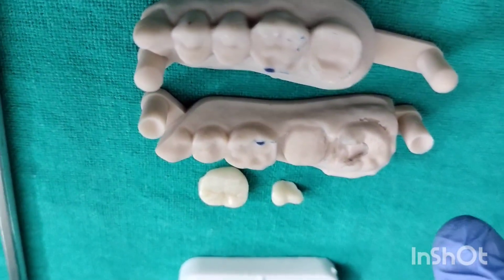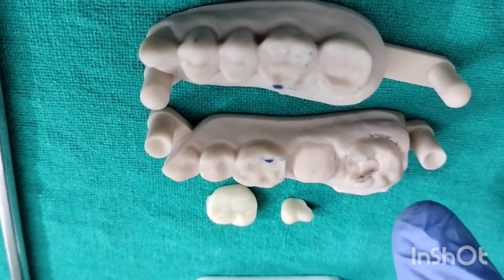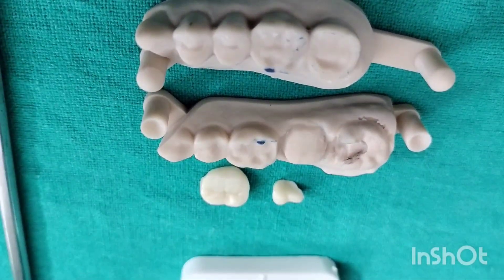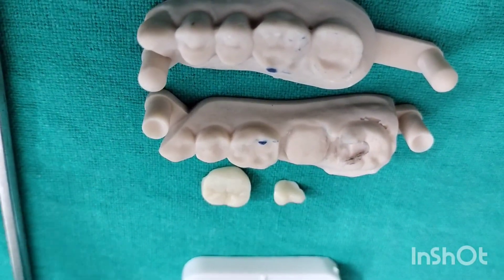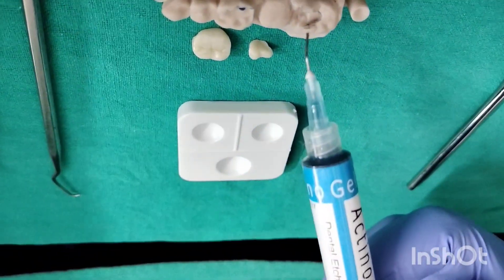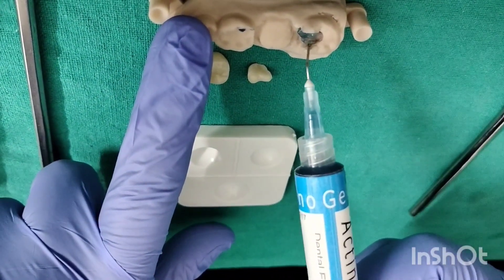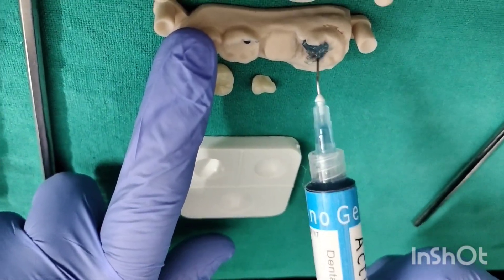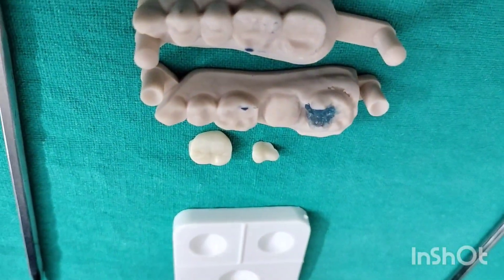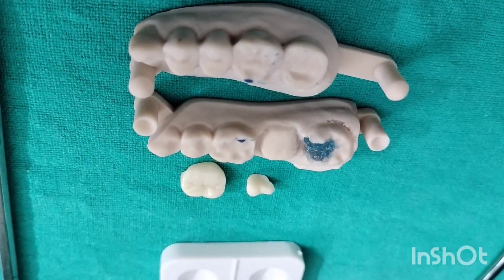Then you have to prepare the surface of the cavity. You will use an etch-and-bond technique. In this you are going to use an etchant, that is 37% phosphoric acid. Apply this onto the prepared cavity like this. Once you have done this, allow for 20 seconds. After that, wash and dry.